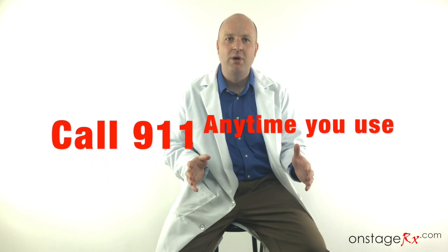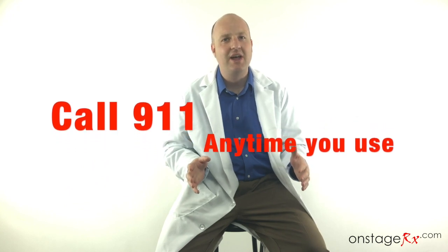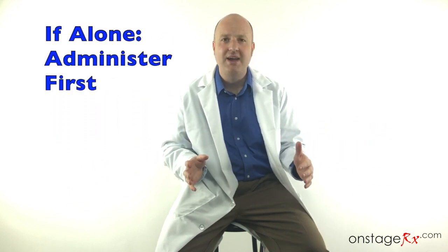Also, if a child has definitely eaten a trigger food, in this special case, it's reasonable to use the autoinjector prior to their symptoms occurring. Again, you should review this with your primary care physician. Always call 911 when you need to use your epinephrine autoinjector. If you are alone, administer the epinephrine autoinjector first and then call for help.